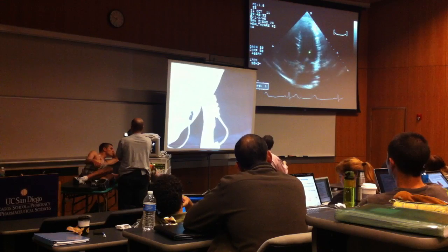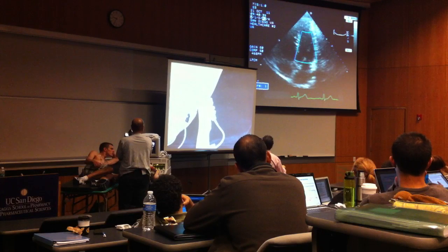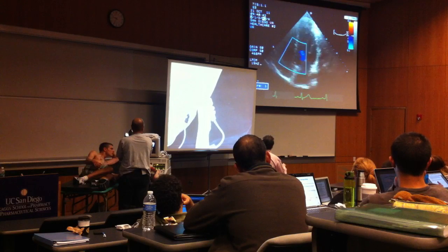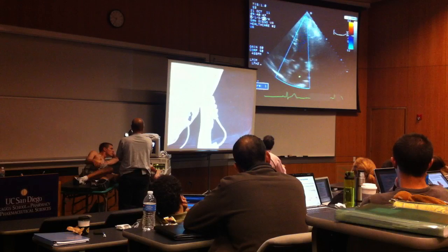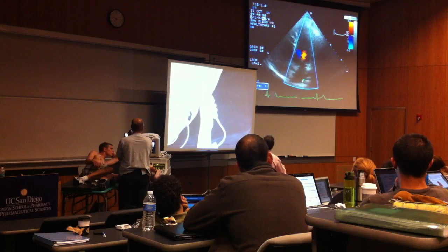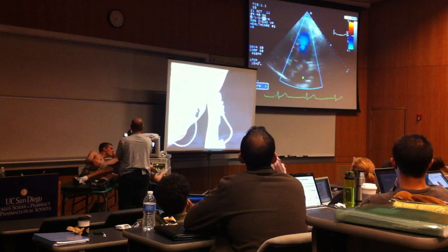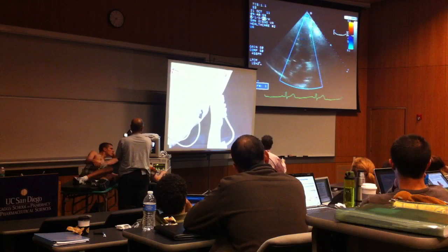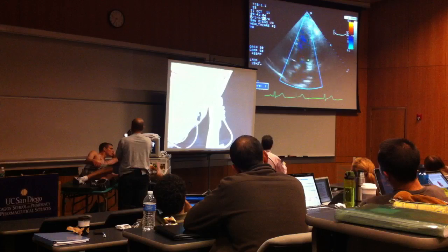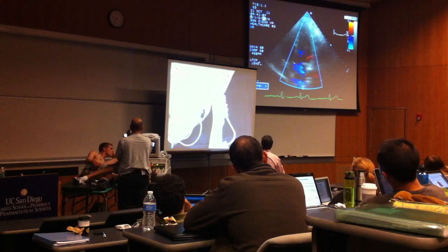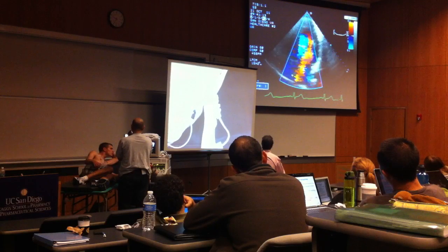This is what we call a five-chamber view. With color Doppler on, we'll see blood flowing from the left atria into the left ventricle. It's color coded so that if it's moving towards the transducer at the apex, it's orange; if it's moving away, it's blue. If it's a high velocity, it can appear as a turquoise color. We can, if we time it right, look at blood flowing from the left atria into the left ventricle and then out the aortic valve.